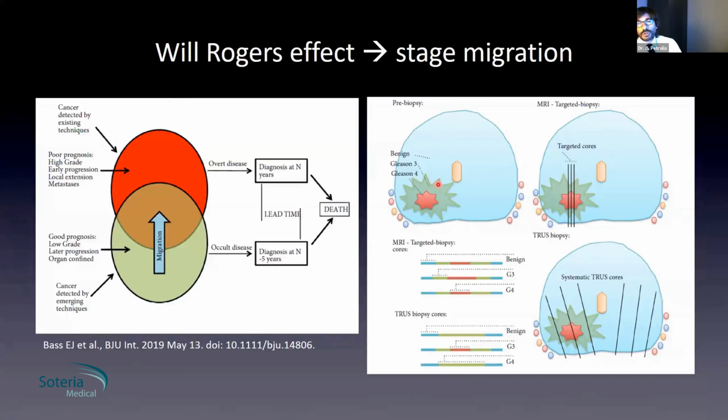The image on the top left shows a hypothetical cancer. What is green is a Gleason 3. What is red is a Gleason 4. If we perform a targeted biopsy, of course, we stick the needle in the most aggressive area. So we tend to stick 3 cores as index samples, all taking the Gleason 4 part. Therefore, the final histology report would be Gleason 4+3.